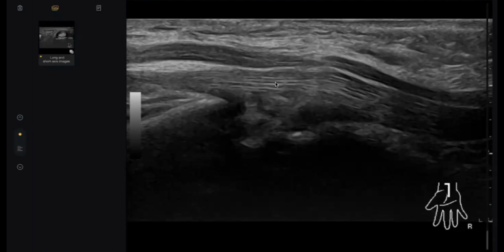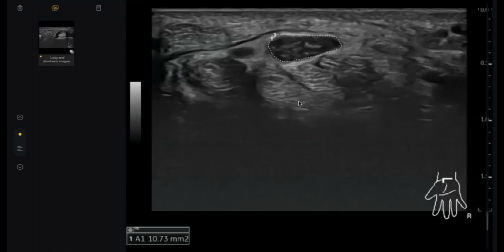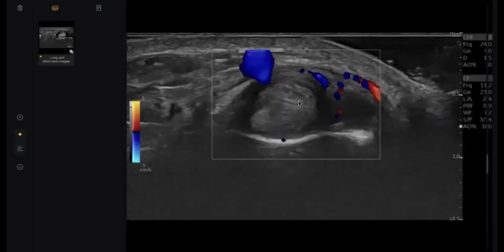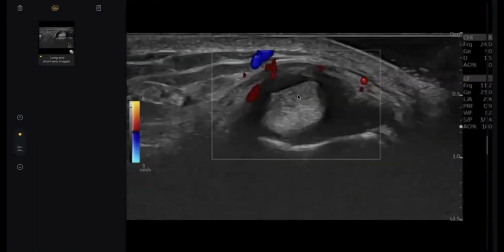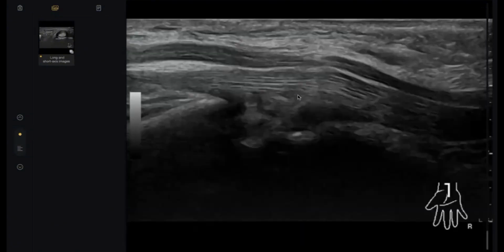Yeah. Look, very good. Okay, my colleague. By the way, this is not the diseased one. This is a normal tendon. Why? Look here at the cursor, at the sign, other than our tendon. But look here, this is our tendon. I think, look here, this is the diseased tendon. This is not the classic, typical parallel fibrillar pattern. Compare this one with this one. Train your eyes, please. Train.